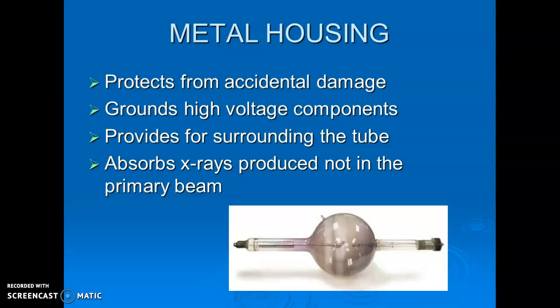I've included a picture here. X-ray tubes used to be made very pretty. You've got some diagrams in your book that show you more what they look like now, but they're housed within this metal housing of the tube head, so you can't see them anymore. So what they look like isn't very important. But 100 years ago when they made these machines, they made them to be very pretty. They were hand-blown glass. They were different colors. This one's kind of a purple and gray.